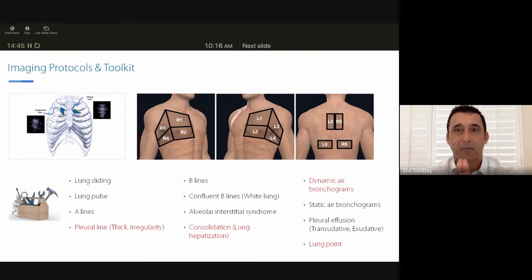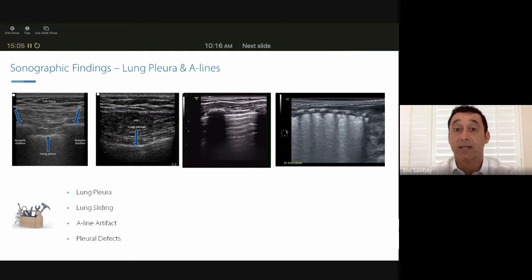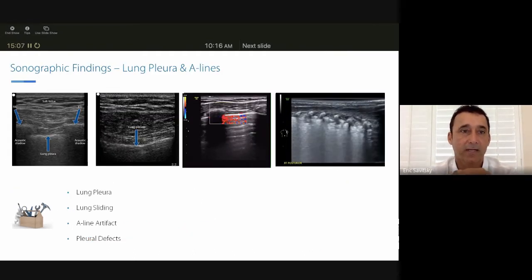Just let the parents know that it doesn't hurt. It's just going to be cold. You have a nice towel, hopefully a warm towel to warm off your patient. And you just go in there, you do your exam as you're talking to the family after you've done your auscultation or before. And you can come out with a really, really good understanding of what's going on in that patient's thoracic cavity in terms of pathological findings.